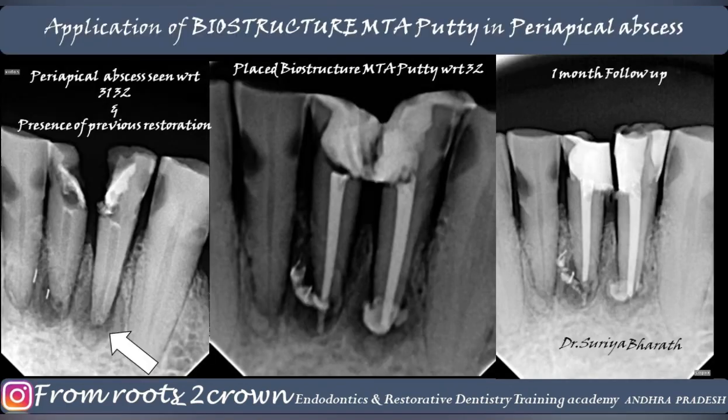After 1 month, this is how the entire apical lesion had decreased, and at the same time the tooth was firmly intact with no other changes with respect to both the teeth, and the patient is also happy.